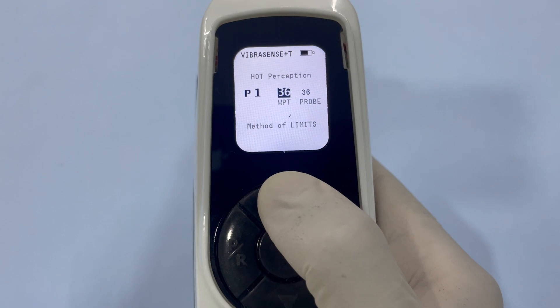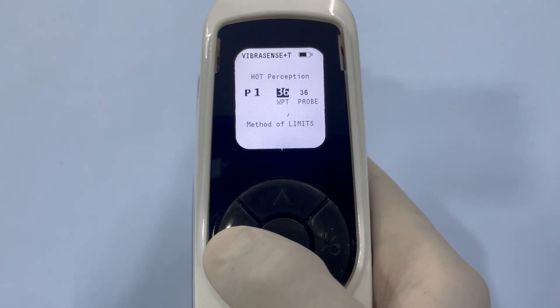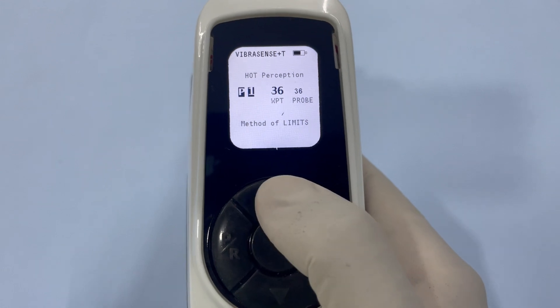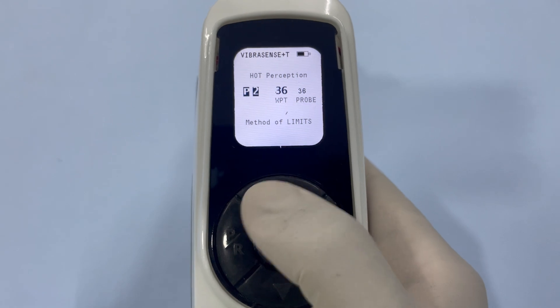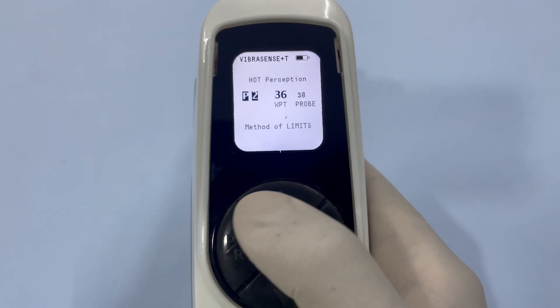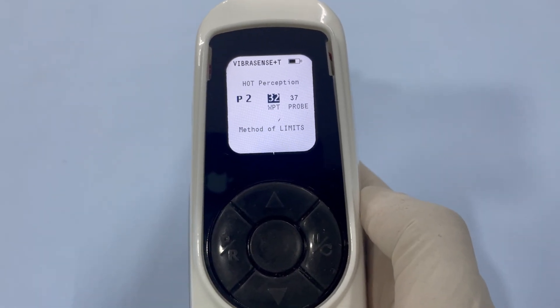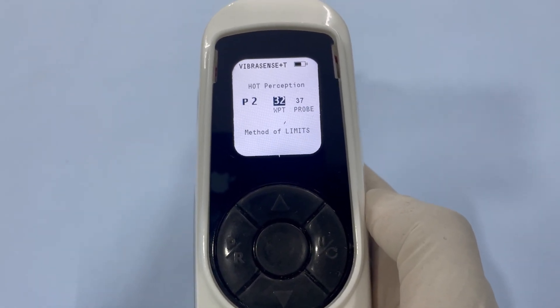After testing at P1, press the PR button to save the recorded data and bring up position 1 on the screen. Use the up arrow to select the next position P2. Press PR again to lock in this position for testing.